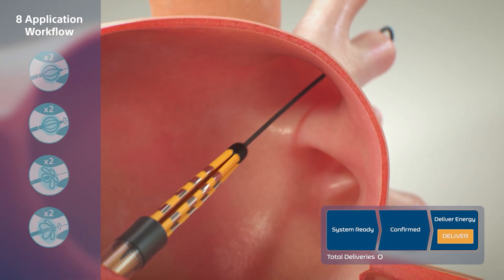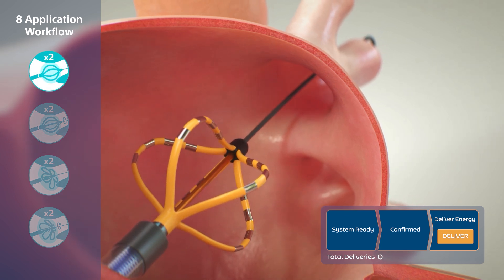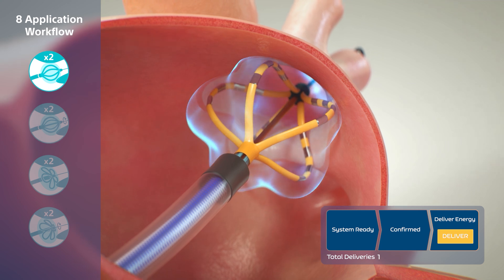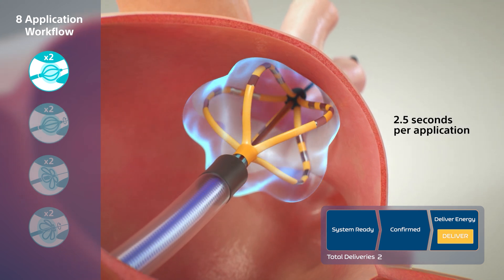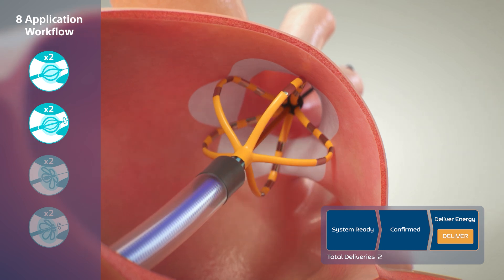The Farawave Catheter is first deployed to basket configuration in the left atrium and positioned in the ostium. Two paired pulsed field applications are performed, each 2.5 seconds in duration, rotating the catheter between paired applications.